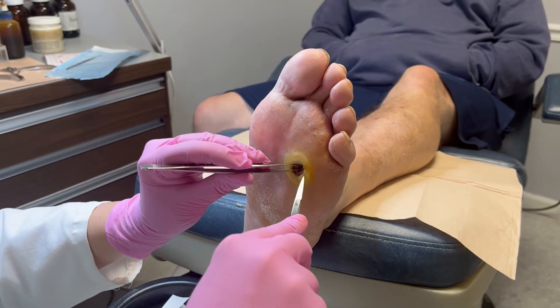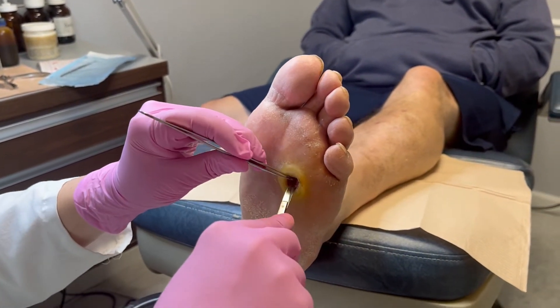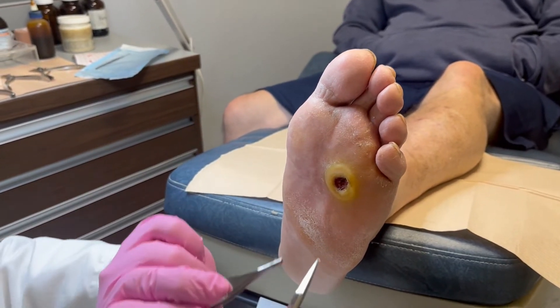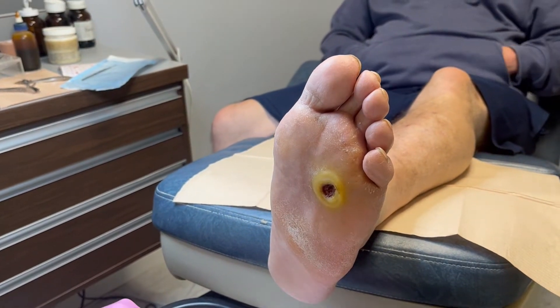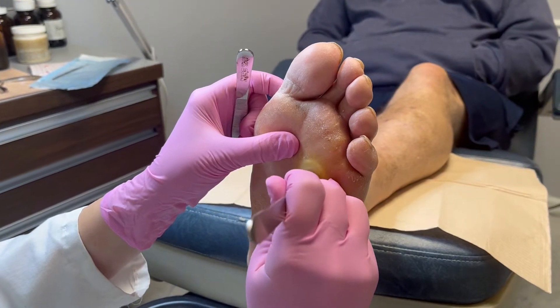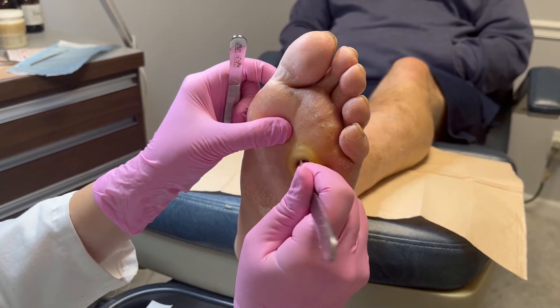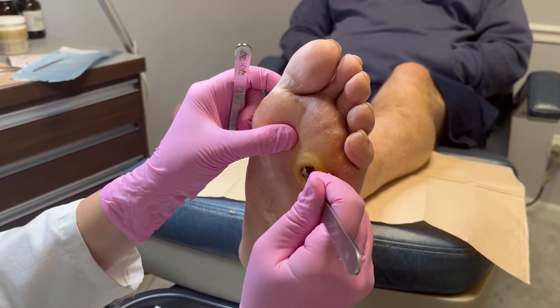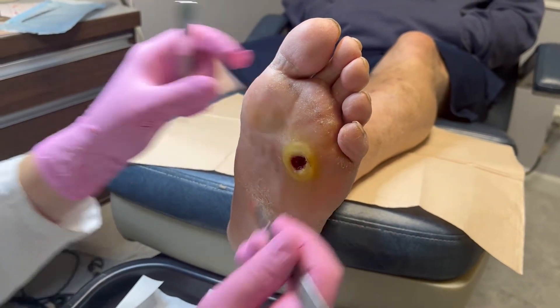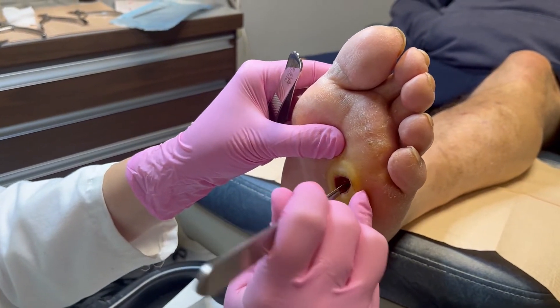Here we're debriding any tissue that's not really going to heal. You see this kind of discolored tissue — this more or less brown discoloration — this just comes right out. We'll get that base bleeding so it'll actually be able to adhere to the graft and encourage the patient's actual cells to go across the graft.